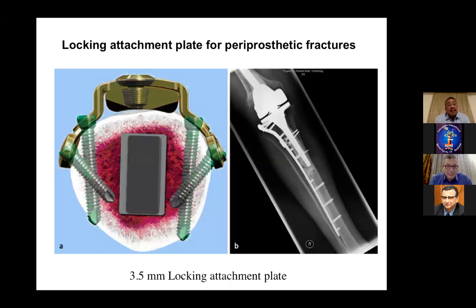Again, one of the developments is the locking attachment plate. It is very useful in periprosthetic fractures, where you can attach this small plate to the locked plate and have screws around the implant inside the medulla.